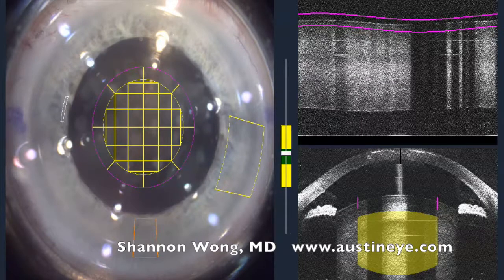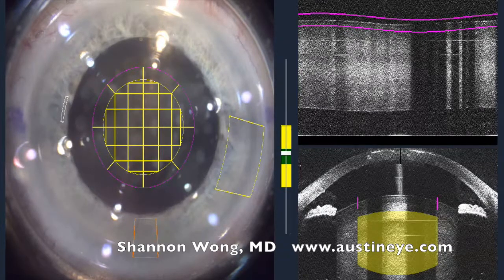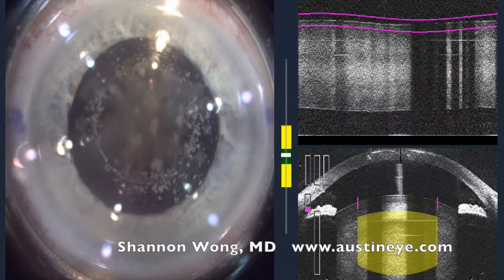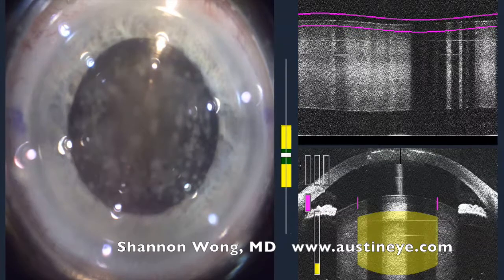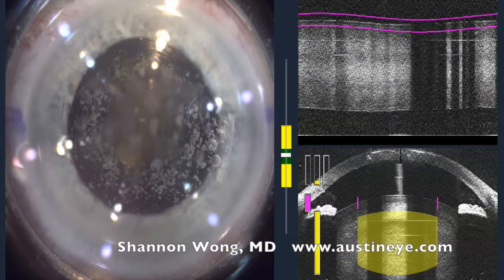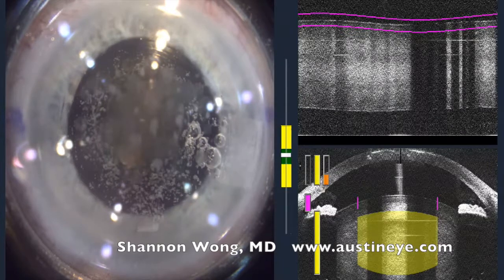The patient's lined up, everything is looking good, and we proceed with the laser ablation of the lens first. The capsulotomy is created — it measures 4.8 millimeters in diameter. You'll see later in this video the characteristic of the capsulotomy that is different than usual due to the shadows cast on the capsule by the corneal dystrophy opacities.